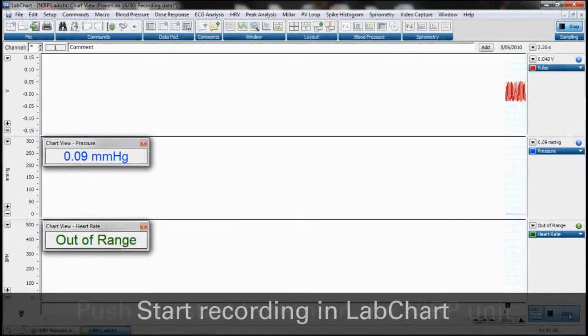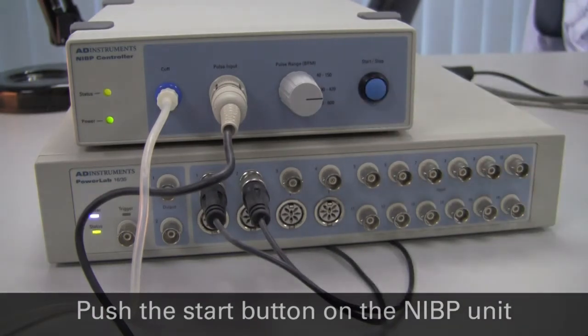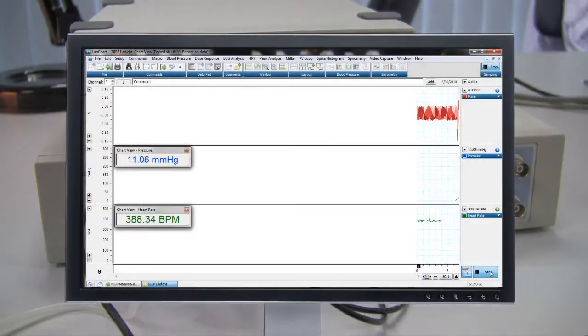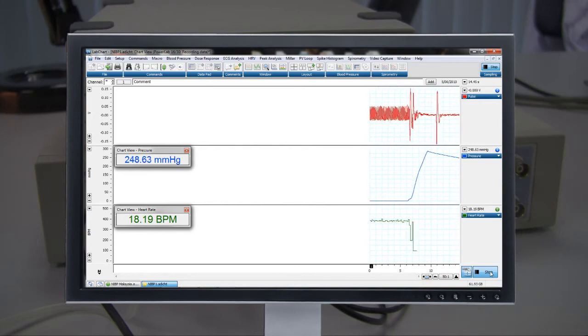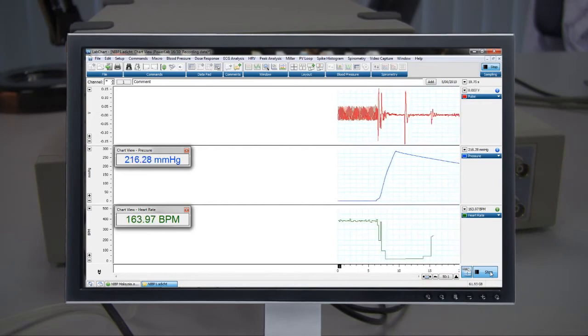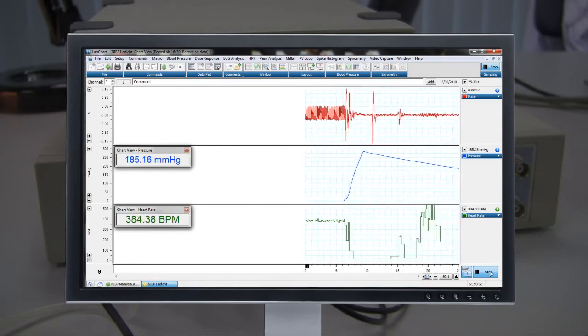Push the start-stop button on the front of the NIBP controller to begin a measurement cycle. The pump should start and the tail cuff should inflate. Observe that the pressure waveform climbs up to the preset maximum cuff pressure; the pulse signal should start to decrease as the cuff starts to occlude the blood flow. When the maximum cuff pressure is reached, the pump will stop and the pressure will begin to drop slowly.